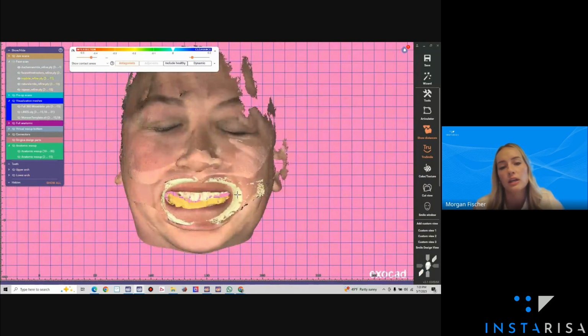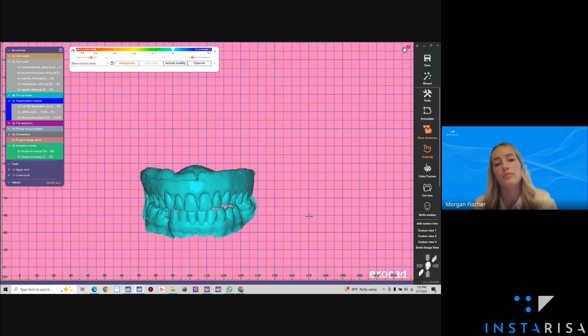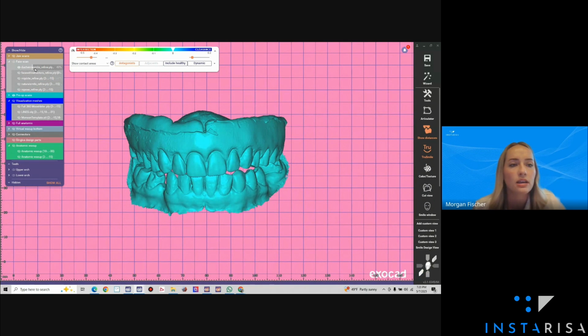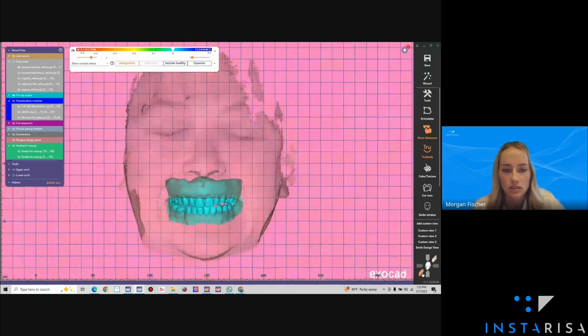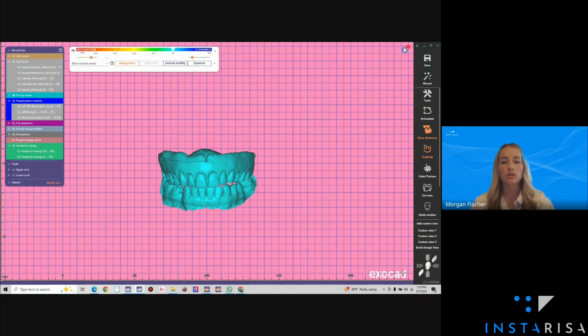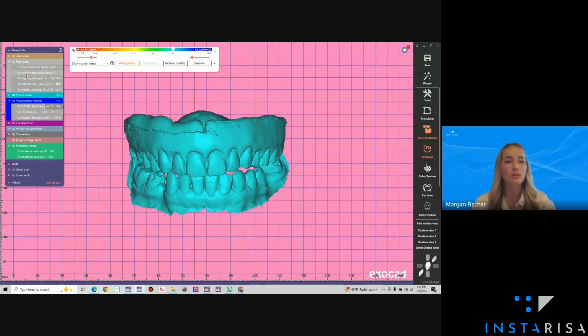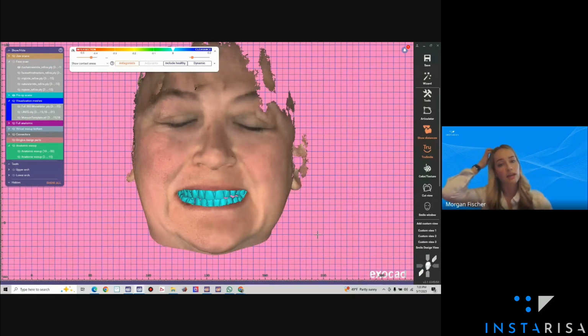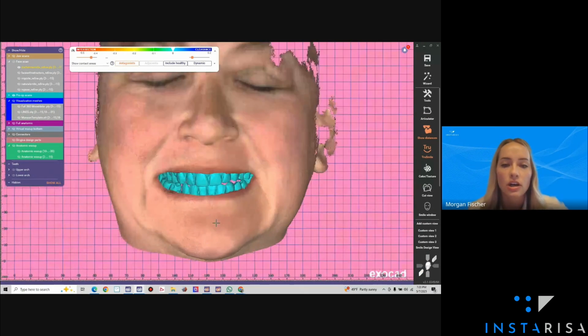So patient's currently wearing a full upper denture and has most of their teeth on the lower. Looks like we're dealing with an upper denture cant here. I can turn on my smiles to see what I'm looking at. Without an intraoral scan or even a 2D photo here, what are you getting in the analog world? When this is being mounted chair side, it's going to be mounted about like so, right? Because we don't know what it looks like in the face. But because I'm able to mount everything on my articulator based off of the face, I can see that this patient has a cant.